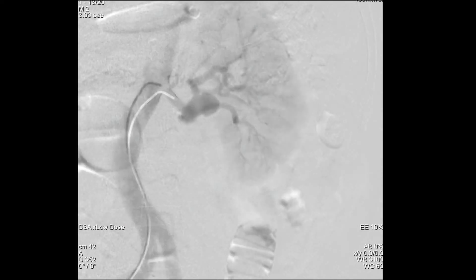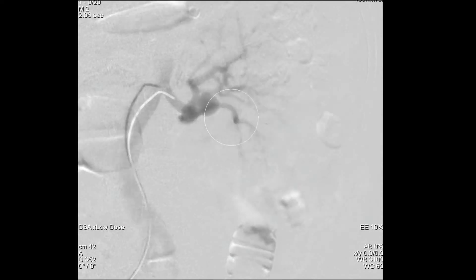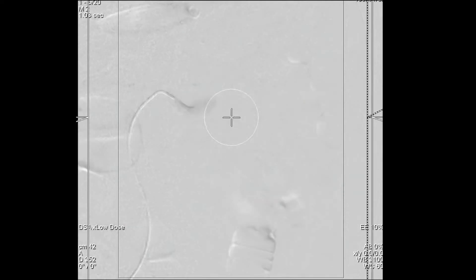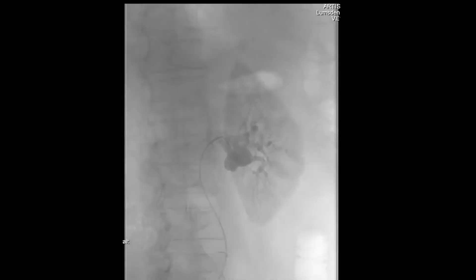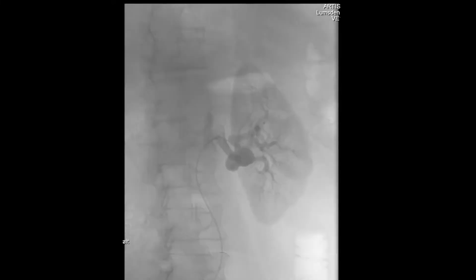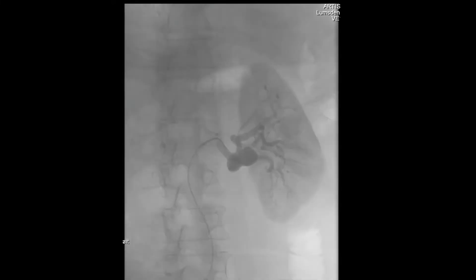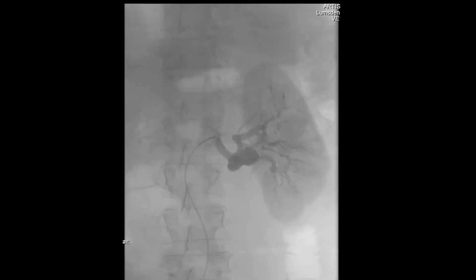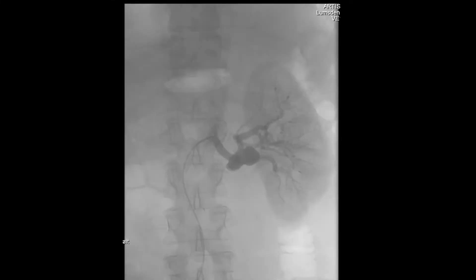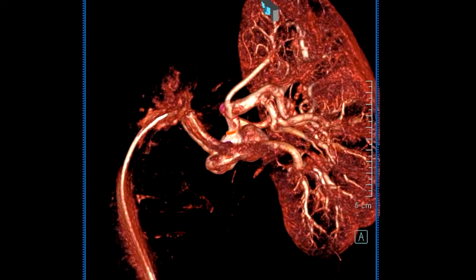A rotational angiogram was then performed. This was done to better delineate the anatomy of this renal artery aneurysm and also to help us perform the endovascular repair of this aneurysm.